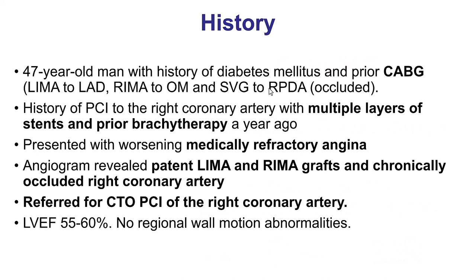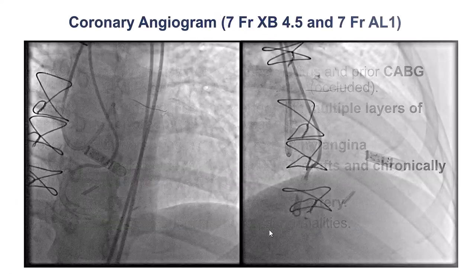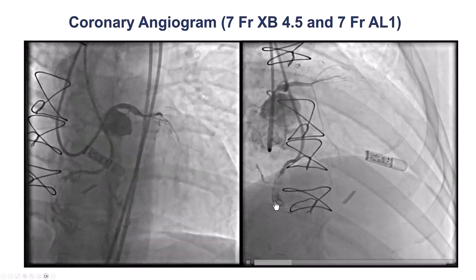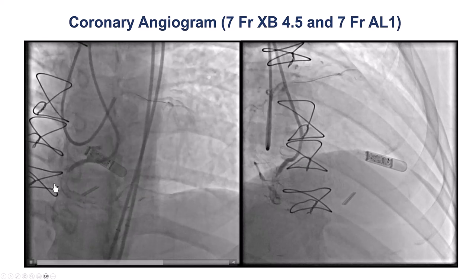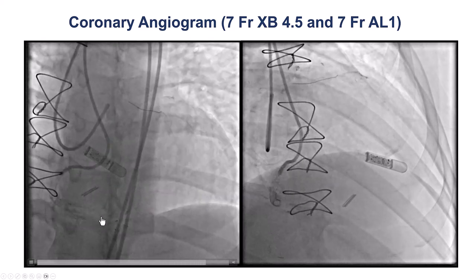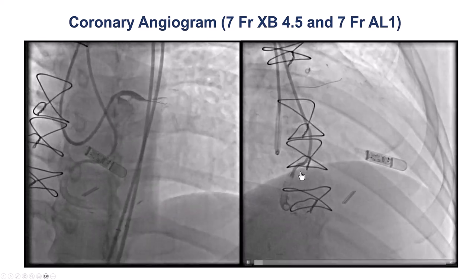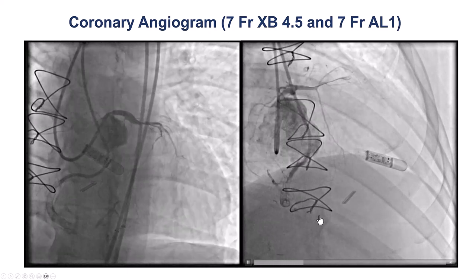The patient was a diabetic with previous coronary bypass graft surgery. He had multiple stents on the native RCA and brachytherapy, and an occluded right coronary artery considered to be a CTO sent for re-canalization. This is a dual injection showing the occlusion within the previously placed RCA stents, going essentially to the PDA-PLV distal bifurcation.